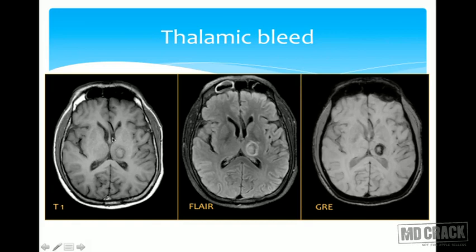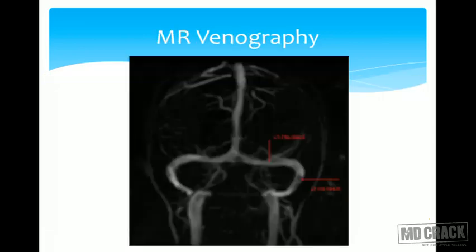Another patient presented with a thalamic bleed. A T1-weighted image showed the bleed within the left thalamus, confirmed on FLAIR and gradient echo (GRE) images. GRE sequences are excellent at picking up small quantities of blood or calcium; however, it is extremely difficult to differentiate between calcium and blood on MRI.